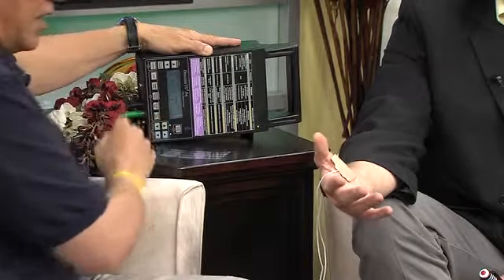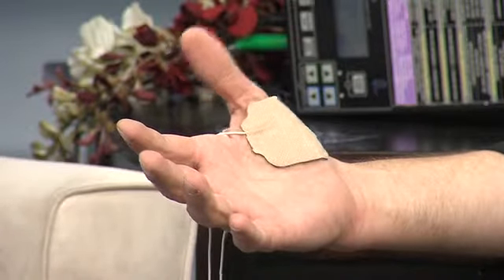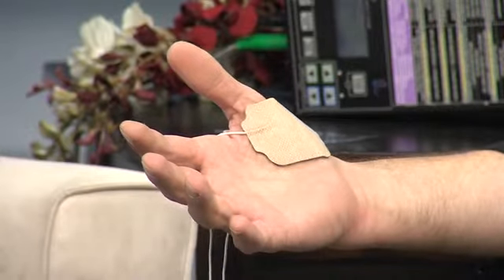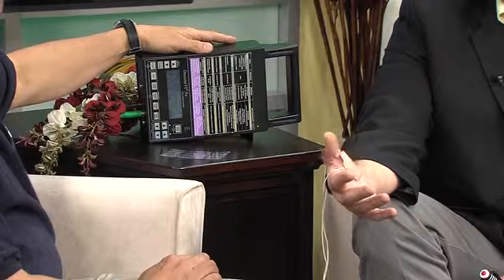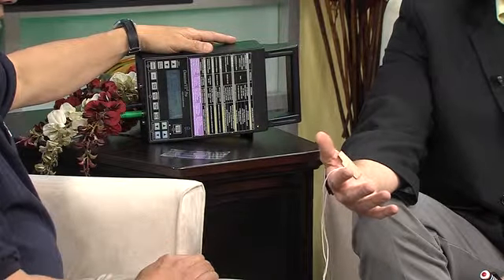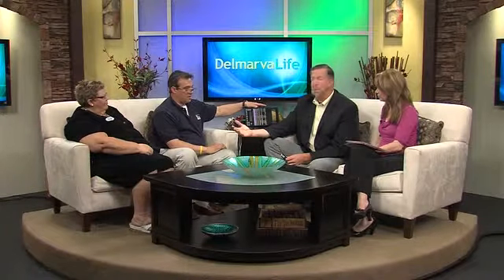You can see the fingers actually moving. If you had had a stroke or a radial nerve injury and were unable to use your thumb — where your mind could not communicate with your hand to get the function — we would do a treatment like this, which runs for about 10 or 15 minutes, and you would start getting the function back in that muscle. That's amazing. And you're not moving it — it's completely electrical stimulation.